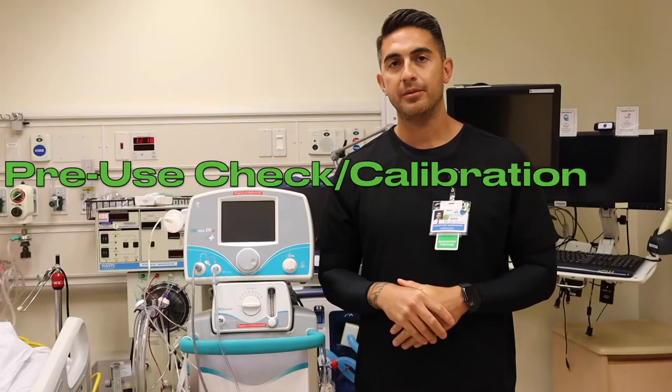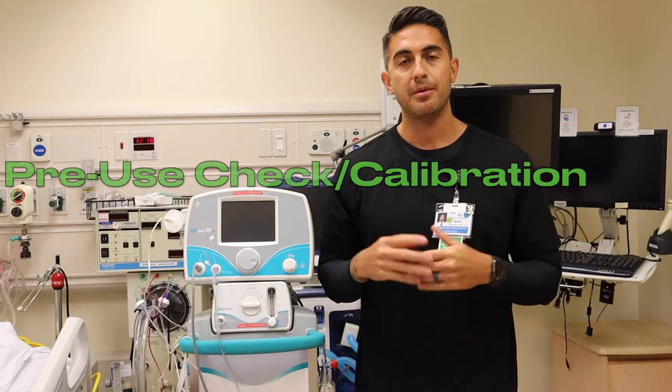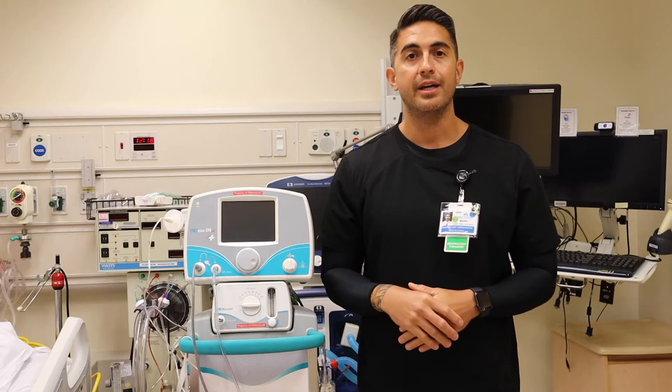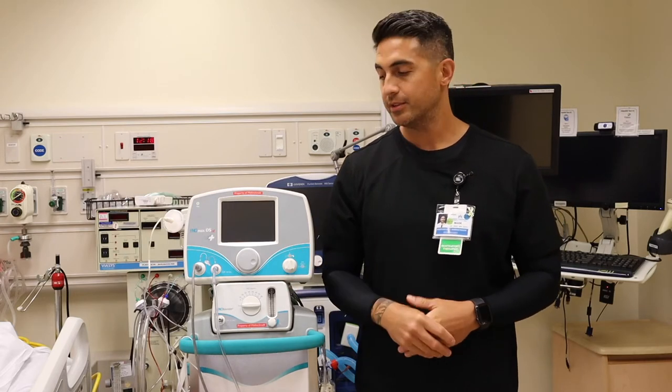Now that we've assembled our pre-use check assembly and circuit, we're going to perform a pre-use check and calibration. This must be done prior to placing on your patients. This test is good for 24 hours and then the test needs to be done again. If you're going to use it on your patient, you have 10 minutes to use it before you need to shut off your tanks. Let's go ahead and do a pre-use check.